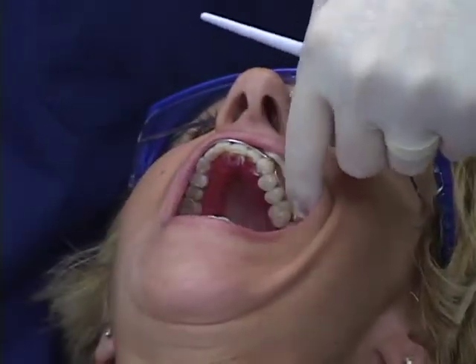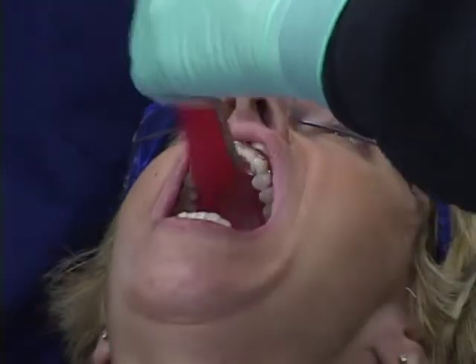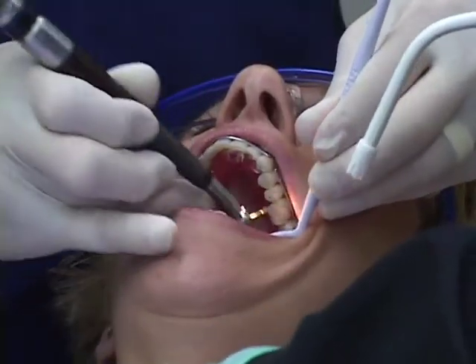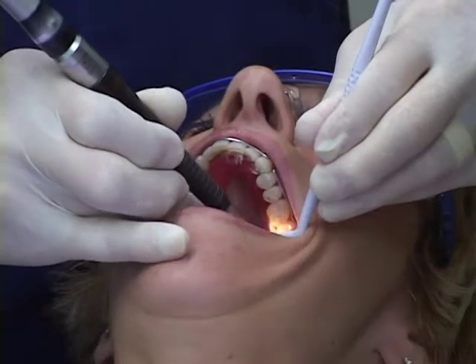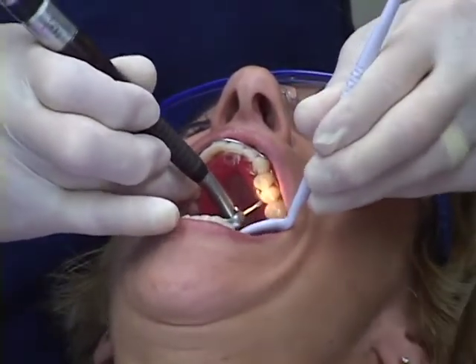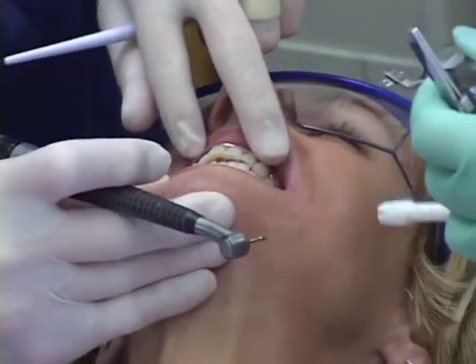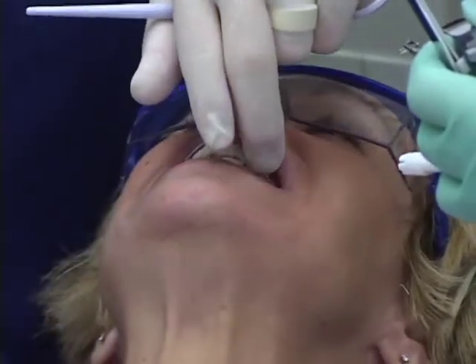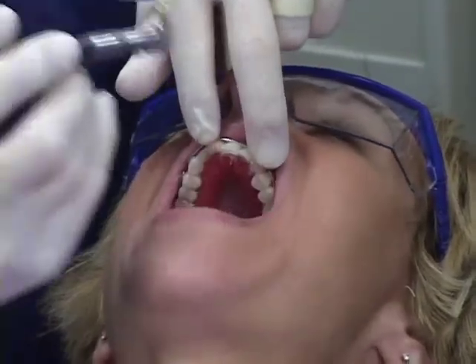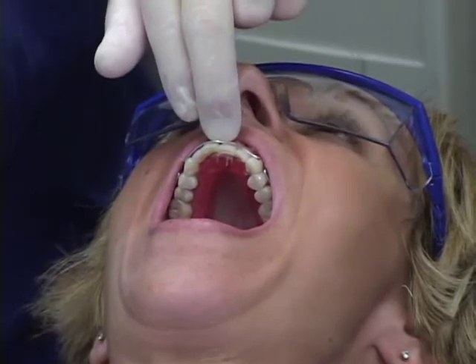Try that one more time. And I want to take a look at the anterior teeth here, what that relationship is now. I would suspect that numbers probably 6 and 27 are probably coming pretty close. Stay close down. Yeah, just a little ways straight. Just a little bit. Okay. Let's take our contact down here a little more. Go ahead and mark that with black. Let's see where I'm at there.